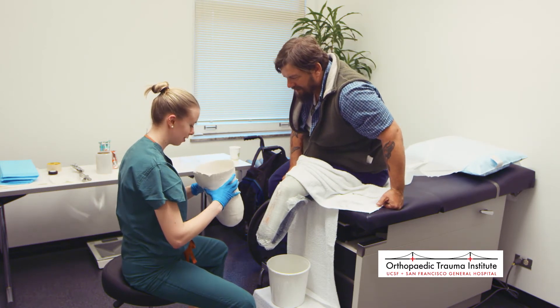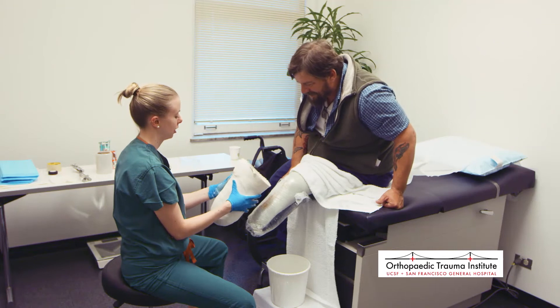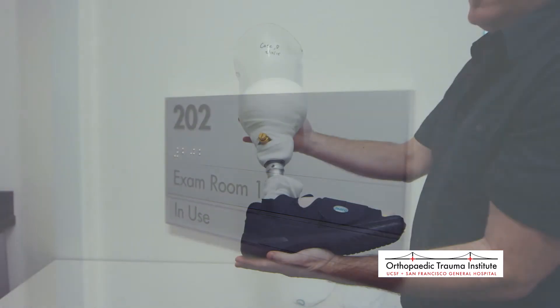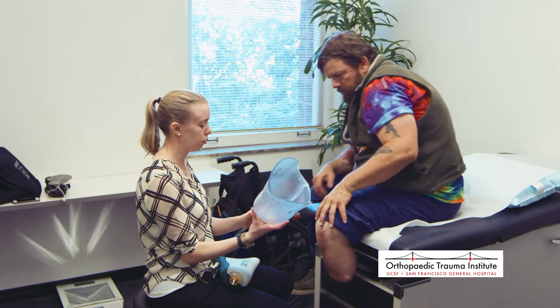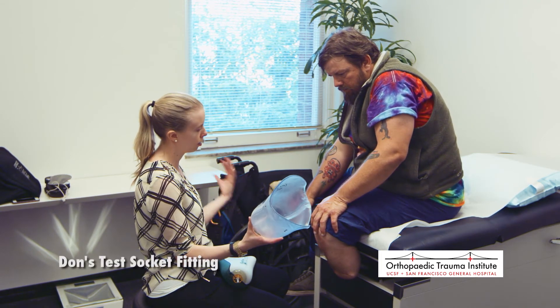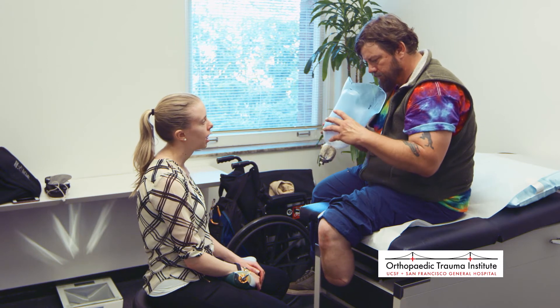As we saw earlier, the casting of a patient's residual limb is integral to creating the test socket. A week after Don's residual limb was cast, he returns to try on the test socket Hannah has created for him. Today, we talked about our goals: to do the initial test socket fitting and to potentially walk — though I didn't guarantee it, because if the test socket is uncomfortable, we don't proceed until we have something comfortable.